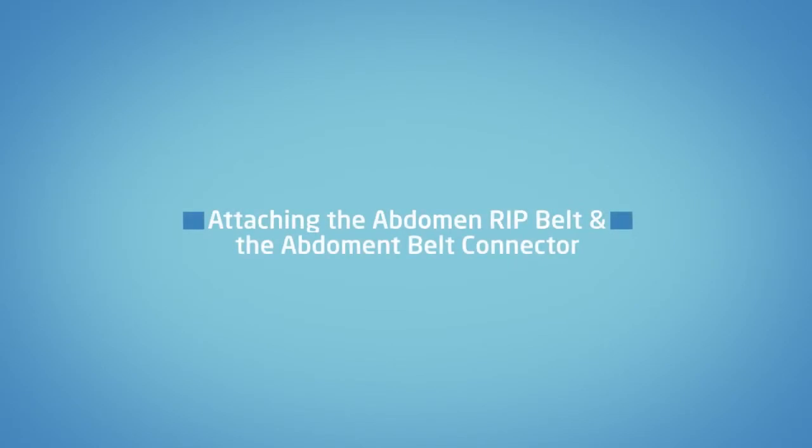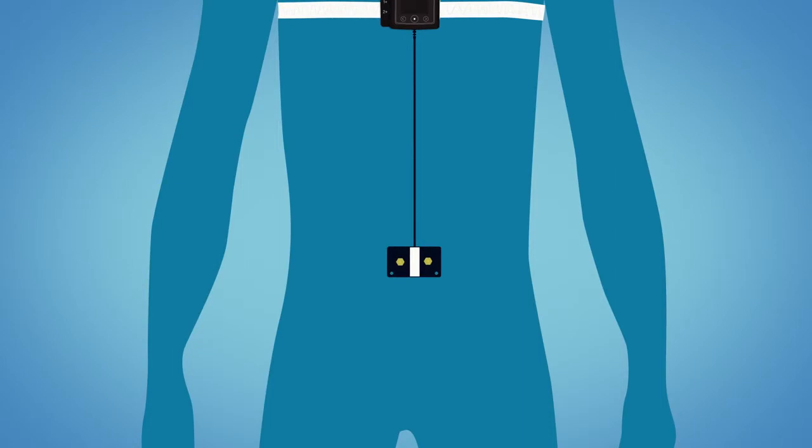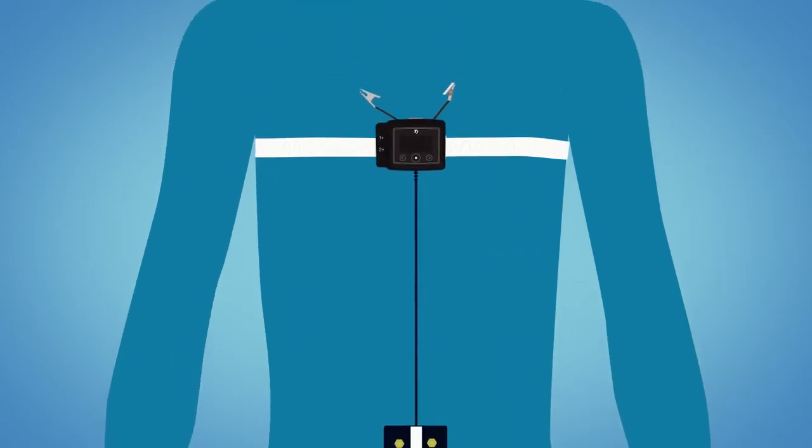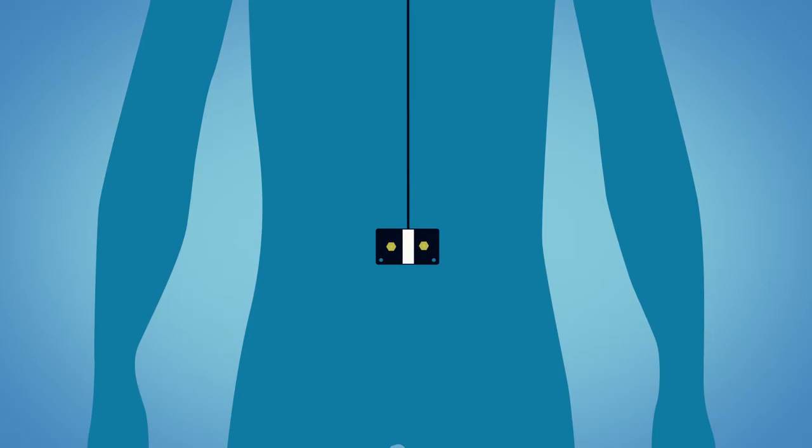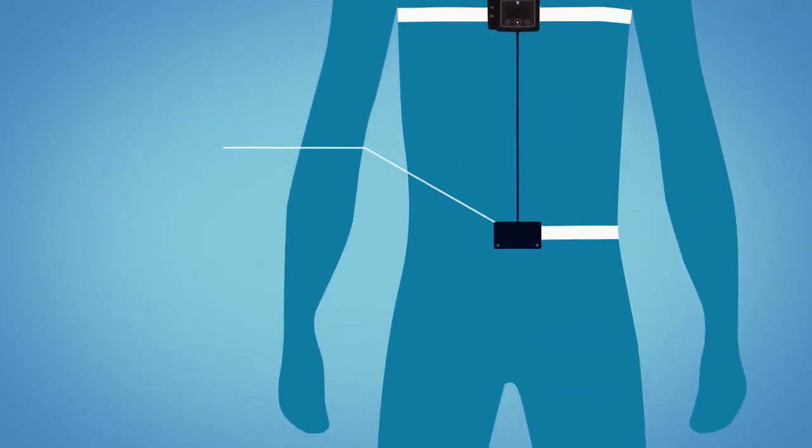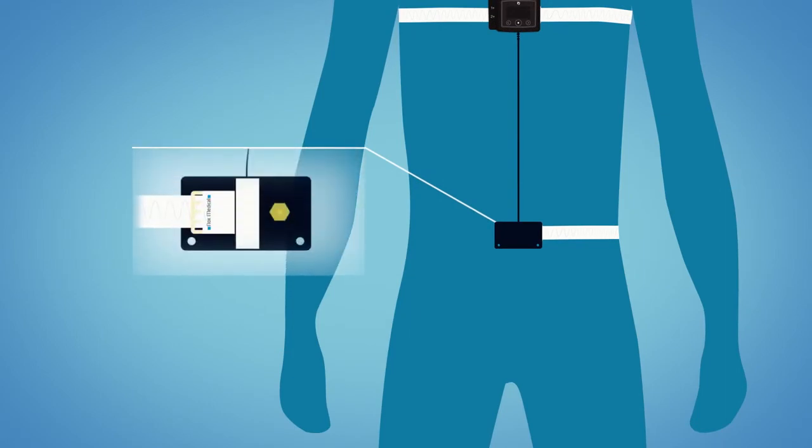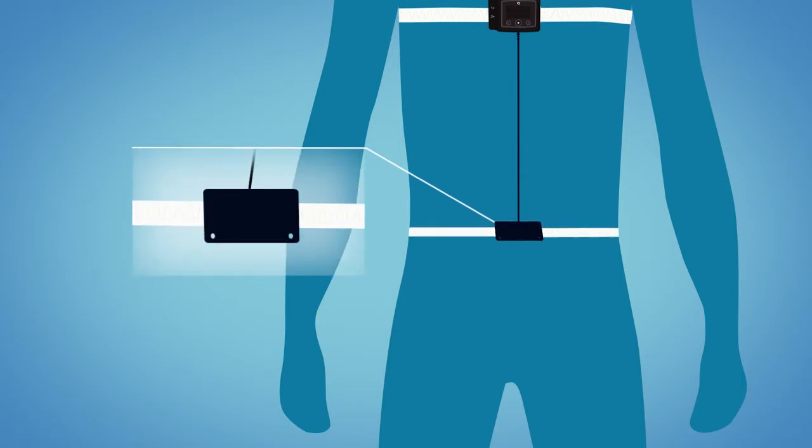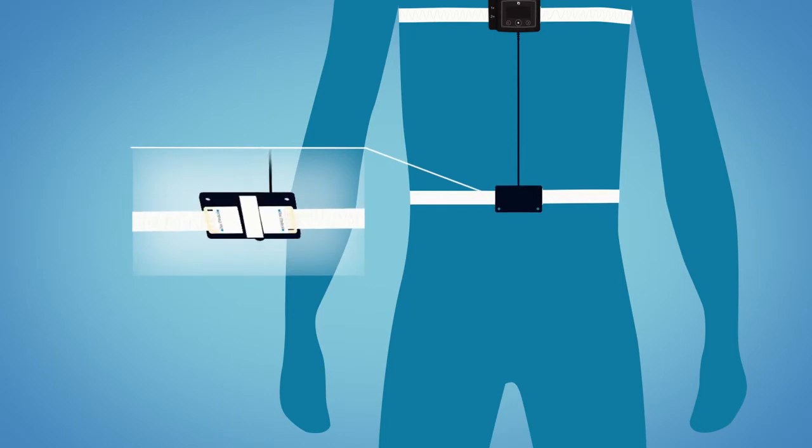Attaching the abdomen RIP belt and the abdomen belt connector. The abdomen belt is connected to the abdomen belt connector that hangs directly down from the T3 device. Be sure the flat side of the abdomen belt connector is facing away from you. Take the second belt and snap one end of the belt to one of the connectors on the abdomen belt connector. Arrange the belt around your back and snap the other end to the lone connector over your abdomen. The abdomen belt should be above your belly button.